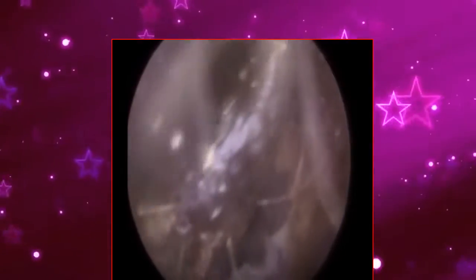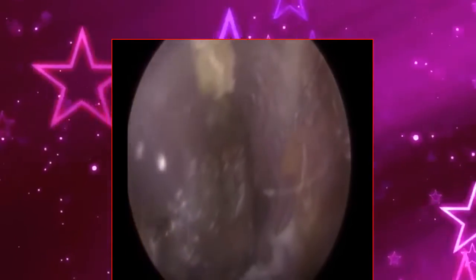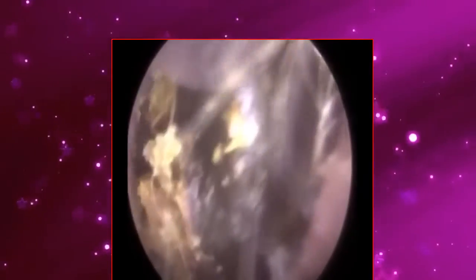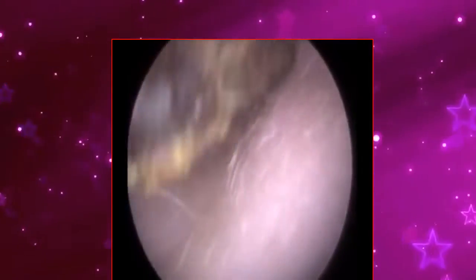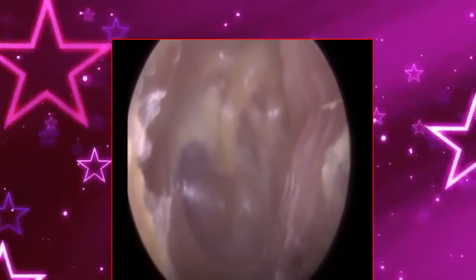So this patient previously had that, and they had it removed, and it's caused an enlarged cavity, and actually this piece of wax was lodged. Sorry, I've not focused too much on the actual procedure, but it'll become very apparent in a moment when I remove this wax what I'm referring to. And I don't think I've uploaded a video showing an eardrum like this before, and an enlarged medial external auditory meatus. So external auditory meatus is the name given to the ear canal, and medial is deep in the ear.